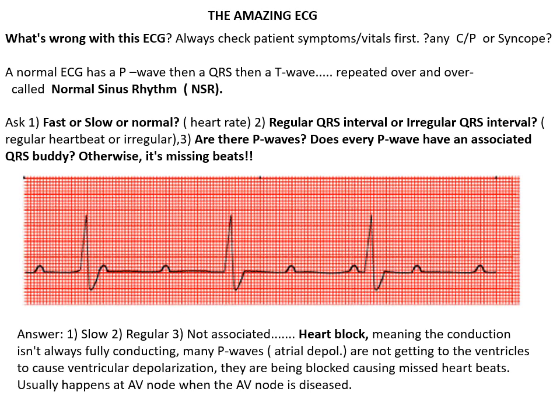So just to be a bit repetitious here, in a normal ECG, the electricity begins in a pacemaker in the atrium called the SA node, and the P wave that we see on an ECG or a rhythm strip is atrial depolarization. Then the next deflection we see on a normal ECG or normal sinus rhythm is the QRS deflection, and that's ventricular depolarization.